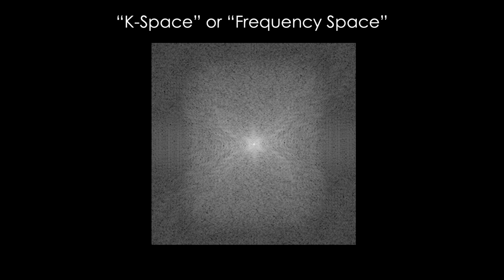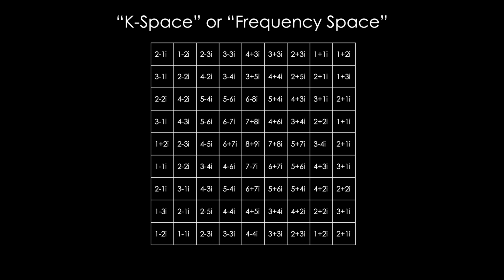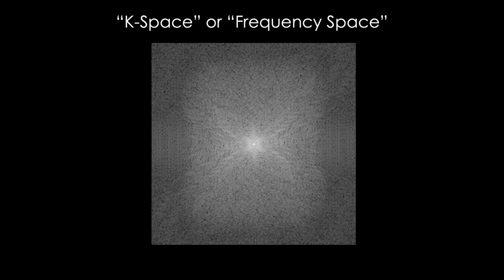It embodies some of the principles we're trying to teach, but I think overall it does more harm than good and creates a lot of confusion. Even if there was something you could visually see from this picture that might improve image quality, at the end of the day, this is the only thing our machine sees, recorded numbers, and any operation to improve picture quality will be made by combing through these numbers, not by a technician looking at this image and making adjustments. Does that make sense to you all?